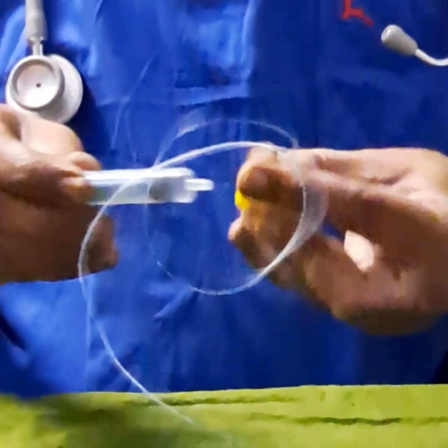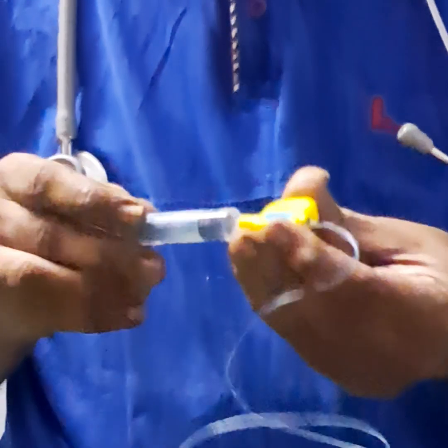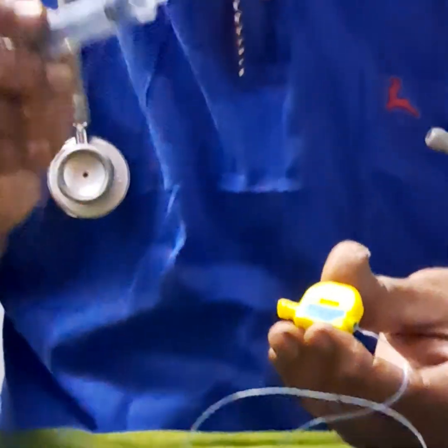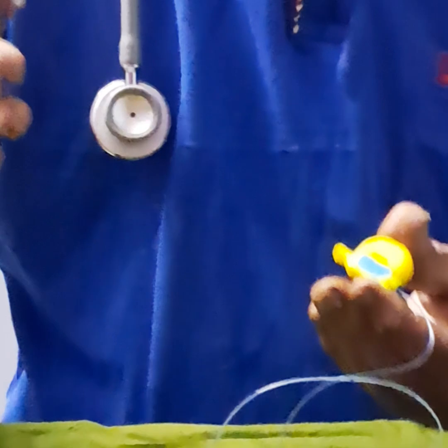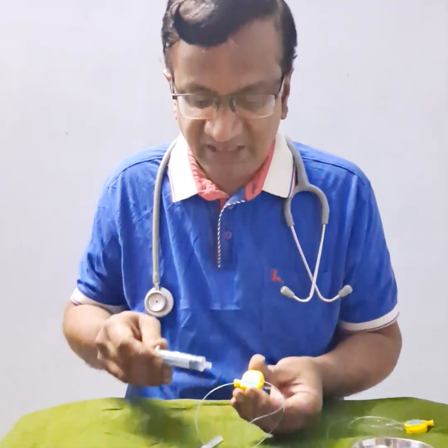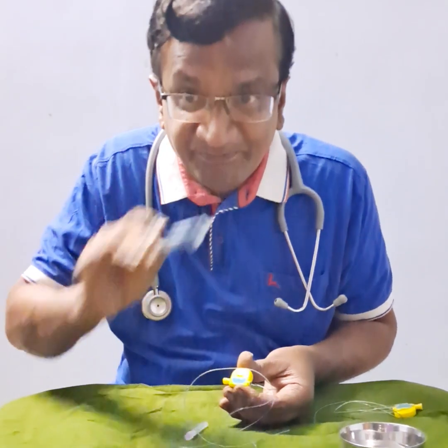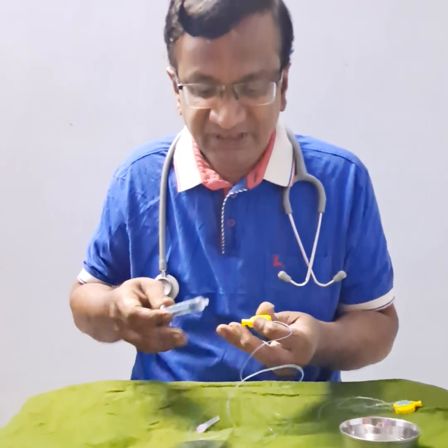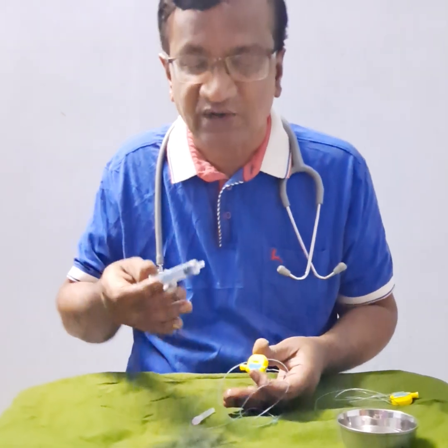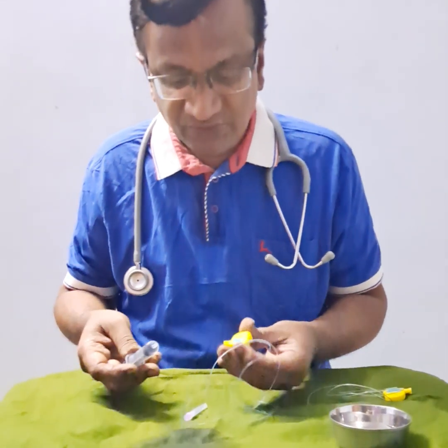Now this adapter has a dead space of 0.2 ml. But if you have a bacterial filter here, that is 1.2 ml. Especially if you are giving thoracic epidurals where we give 4 to 5 ml, we need to understand whether we have completely pre-filled the bacterial filter. If you have not pre-filled it, it will take around 1.2 ml on its own, and then only the drug will go.